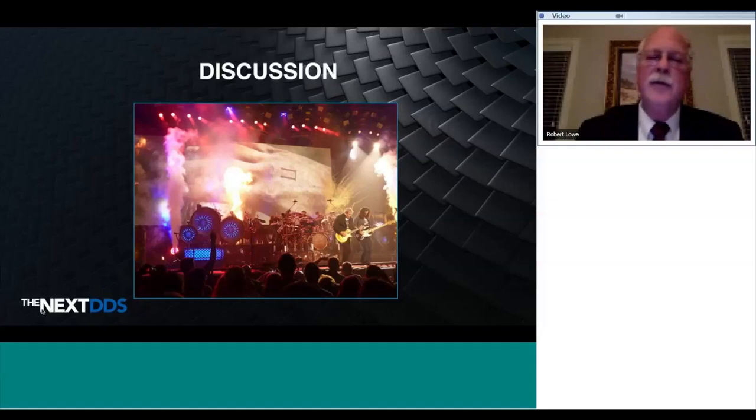There have been some times when I've been conservative not to take out a small piece of old filling material that I've placed previously, and then at the impression appointment, I decided, you know what, I'm just going to do it. I take the temporary off, do my core, and then take my impression. So it's going to be a case-dependent thing. But I will tell you this, you can't go wrong by removing any old core and replacing it.